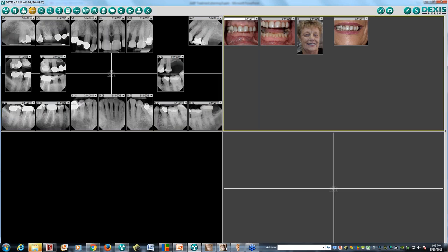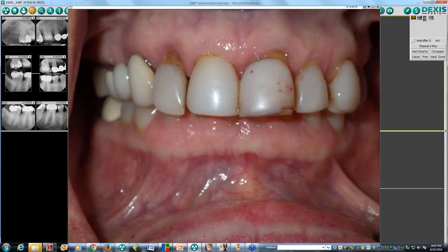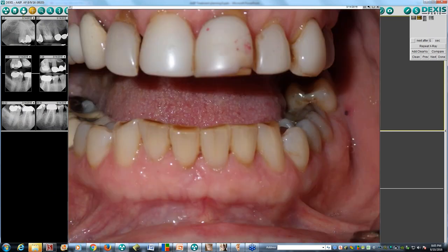Looking at her photographs, you can see the depth of her overbite, the over-contoured crowns — these appear to be acrylic veneers or acrylic crowns that have been placed. There's a dual bite here: the lower anterior teeth are at one level, the lower posterior teeth at another. And there's tooth number 18 — I wanted to save it not for restorative purposes, but for orthodontic anchorage.